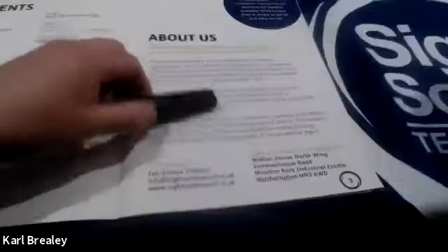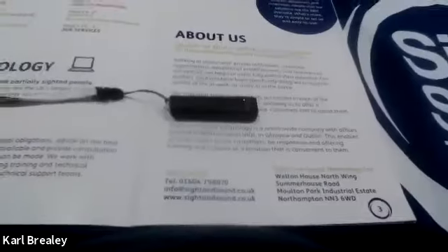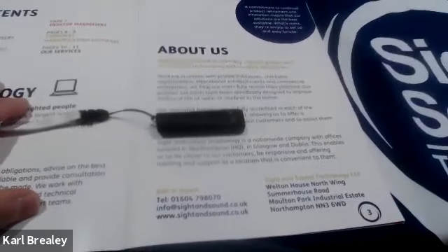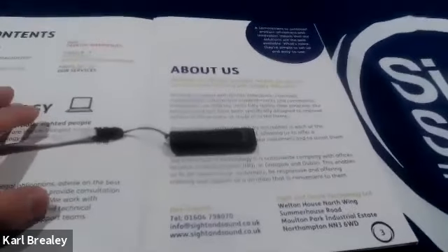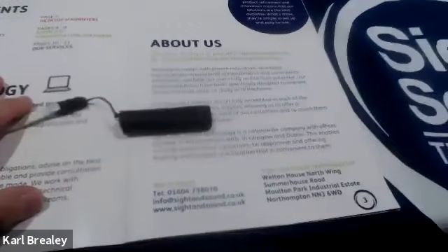And where is the speaker? The speaker is just in the end. There's a little tiny speaker right by the closest part that goes to your ear when it's connected. And it will also connect to Bluetooth. So if you are blind and you've got a dog, walking around, you could have one earbud in, and it connects by Bluetooth to that. If you are wanting to take pictures and stuff, it'll do it. And obviously, if you wanted privacy while it's reading, in an ideal world, you'd have it connected to something.